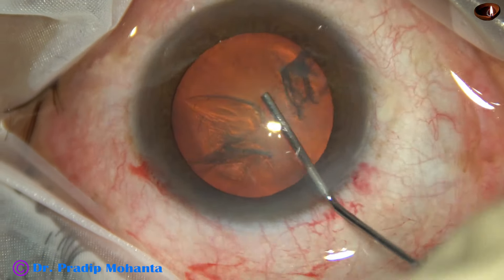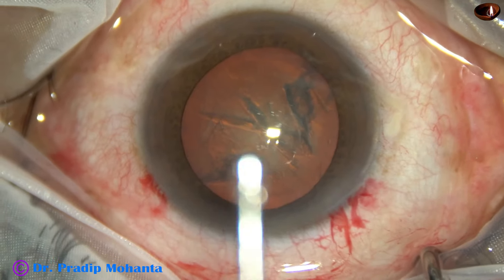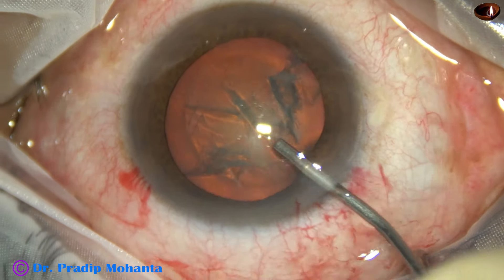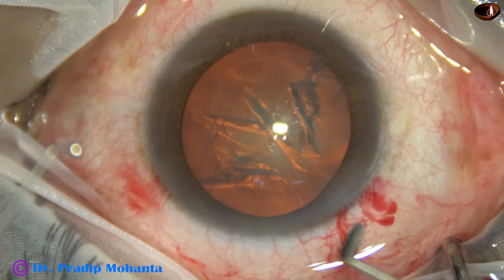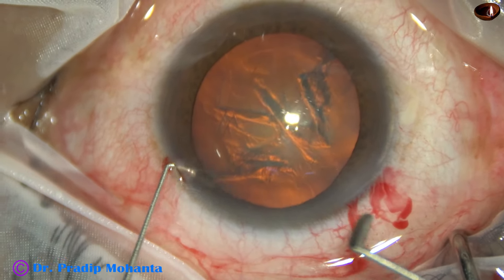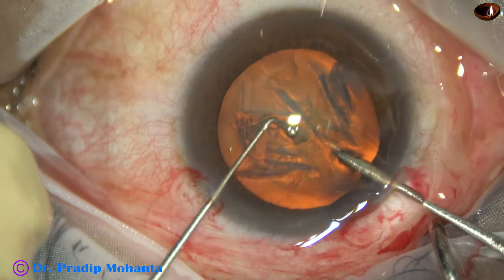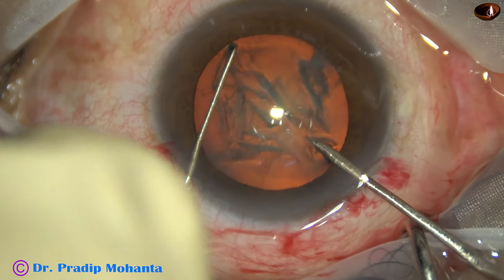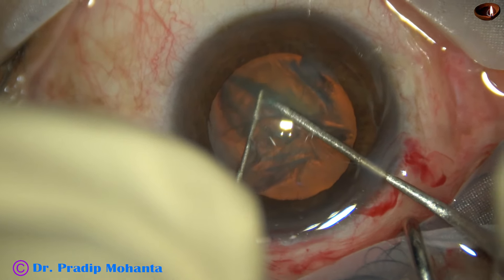The nucleus is tapped. At this moment, I did not rotate the nucleus. Now I am going to use a pre-chopper designed by me, known as Mohanta's pre-chopper. This pre-chopper is made of stainless steel, and the sustainer also is made of stainless steel.